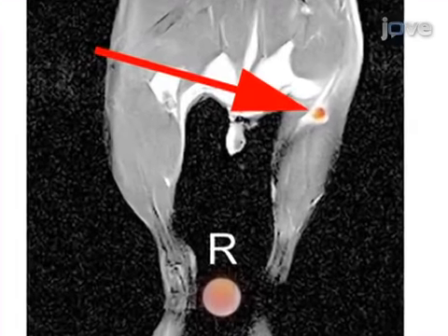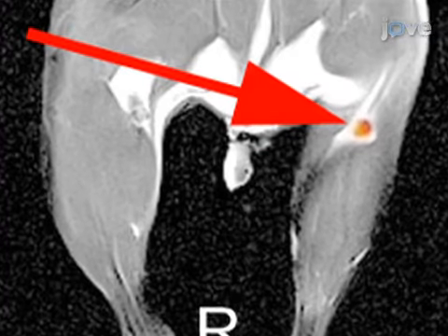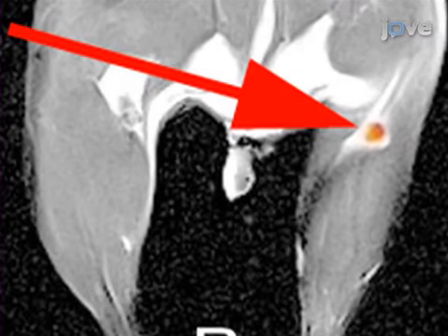Ultimately, 19F MRI for in vivo cell tracking can be used to study the transferred cells in terms of their localization and numbers over the relevant length of time, given certain assumptions as outlined in the text.